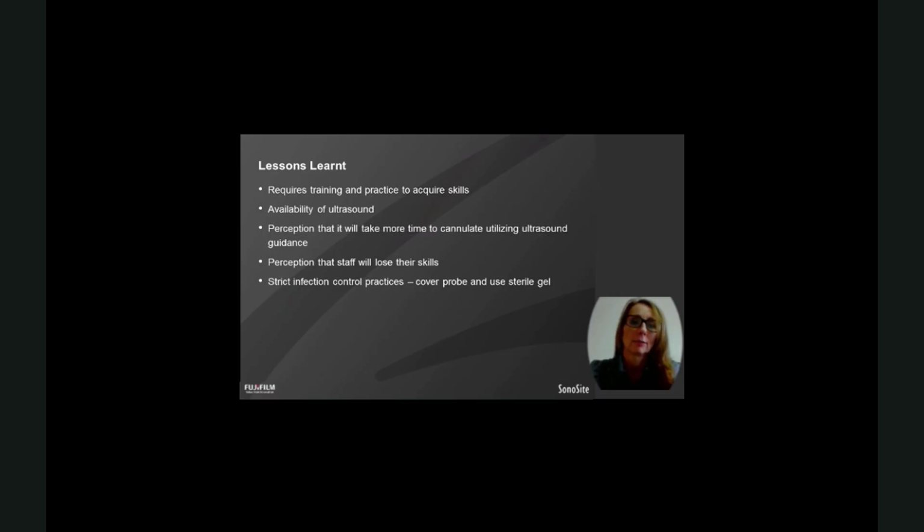I like to have a competency and assessment package which includes a bit of theory, then some training on a phantom arm or a phantom gel mould, and lots of supervised training with that so that they learn quickly. And then I get them to scan fistulas that aren't being used yet, so the patients aren't getting distressed because they're being delayed to be put on.